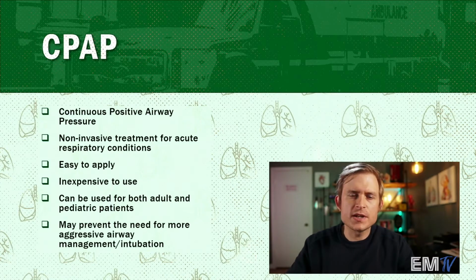Originally, CPAP was designed to help people with sleep apnea, but it has wonderful pre-hospital emergency medicine applications as well. It's a non-invasive treatment for acute respiratory conditions, and we'll talk about several of those in the next few slides. Very easy to apply, takes very little training to do so. Very inexpensive to use, not a lot of specialized equipment needed here. We can use this for both adult and pediatric patients if needed.